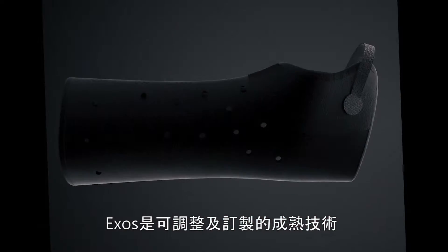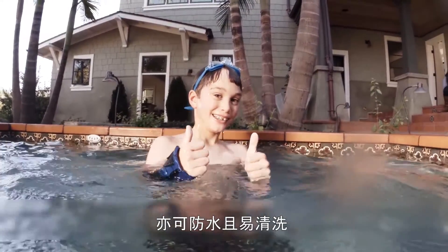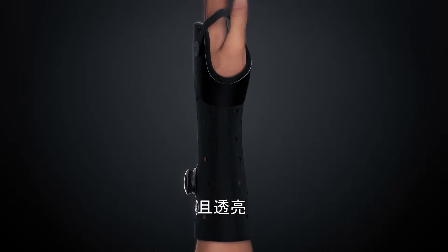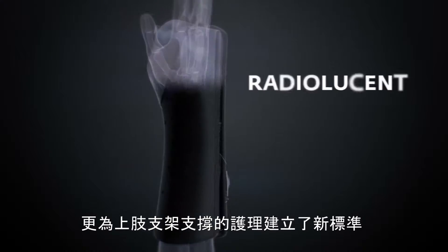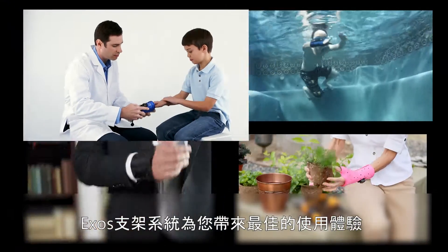Exos is proven technology that is reformable and customizable, easily applied and removed, waterproof and easily cleaned, low profile and lightweight, and radiolucent — establishing a new standard of care in upper extremity bracing. The Exos Bracing System means a much better patient experience.